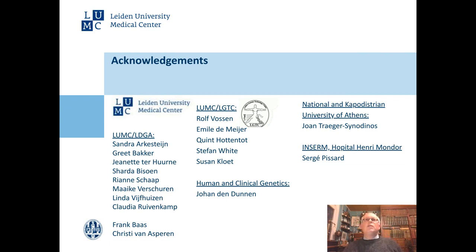Well, that is also a very good question. I know of databases showing DNA results, and hemoglobin VAR sometimes also gives some information about the different separation methods at protein level. But what I think might be useful is the atlas that CBI is providing to its clients. There you can find a lot of different patterns in relationship to the DNA genotype. So I think that would be a way to go.